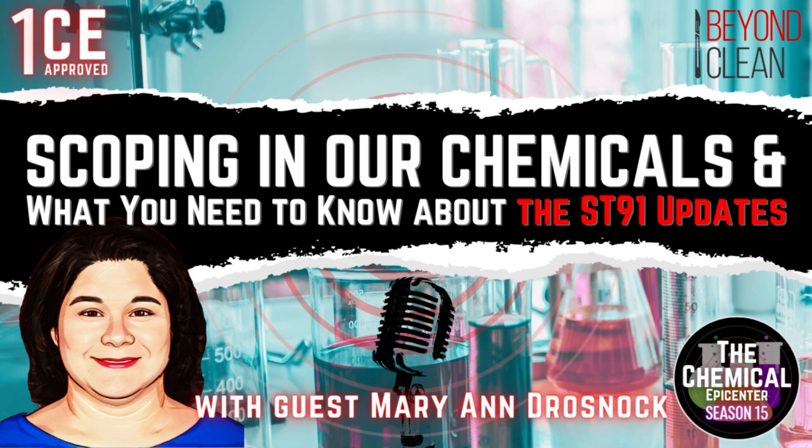I know that's kind of a constant conversation in the industry. If you're constantly over this sink, do you want it to have a smell? Do you not want it to have a smell? Do you want it to have a color? Like you mentioned, the very important point about leak testing in water only, right? If you've got a clear detergent, that could be a little challenging if you're relieving someone or just have not a very good memory like me. So do you land any place on that? What's your feedback around those two things?